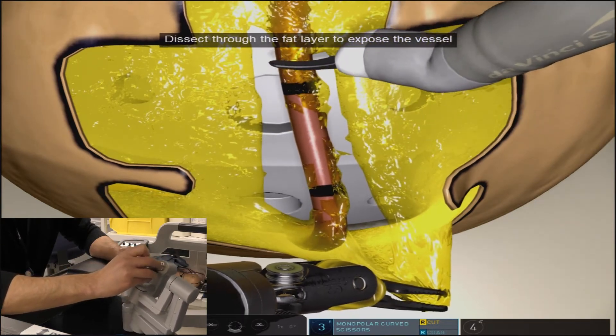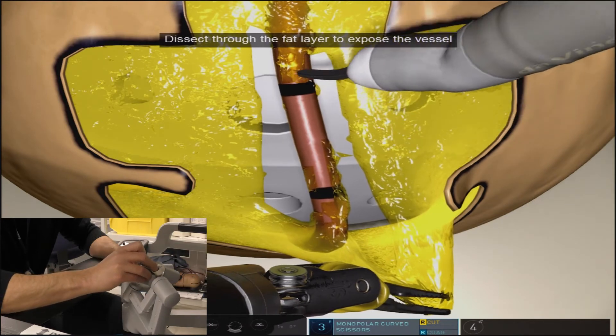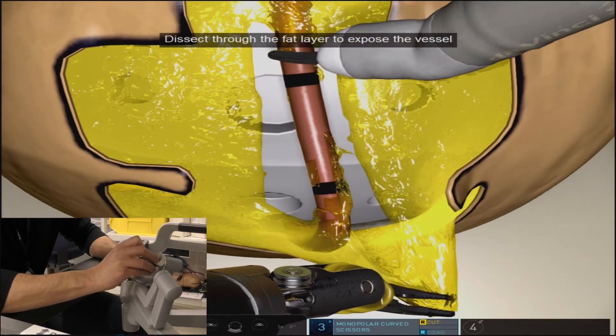As long as there still is some residual fatty tissue on the anterior surface of the vessel, the exercise will not allow you to proceed to the next part.